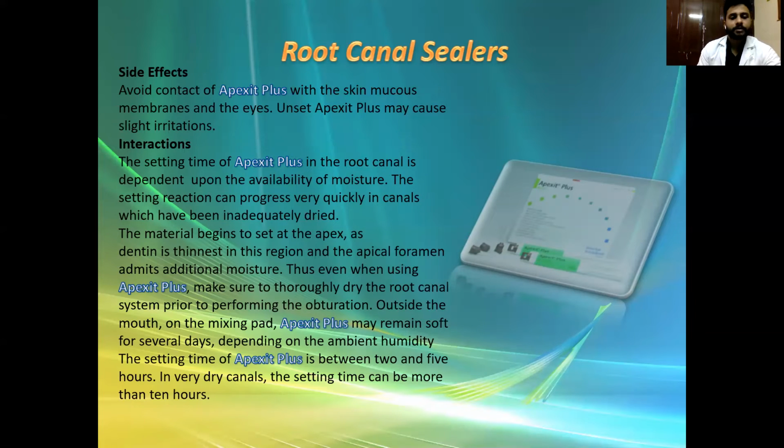Apexit Plus may remain soft for several days depending upon the ambient humidity. The setting time of Apexit Plus is between 2 and 5 hours. In very dry canals, the setting time can be more than 10 hours also.